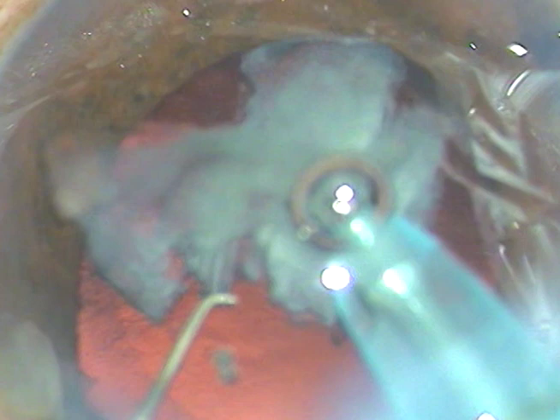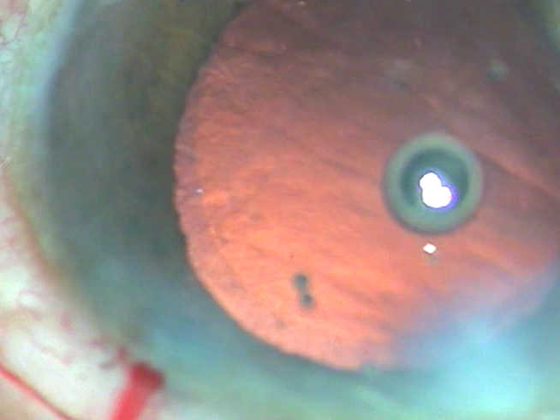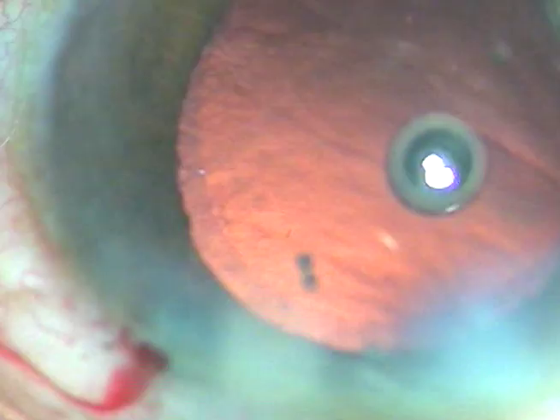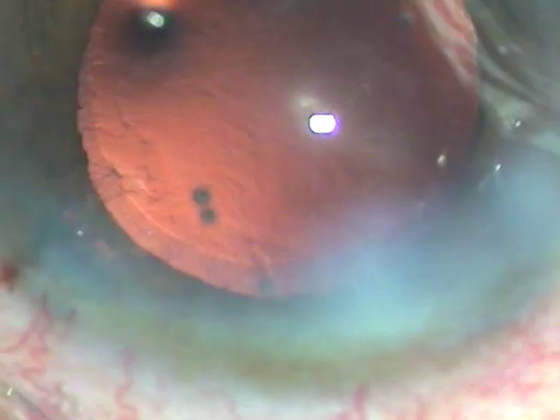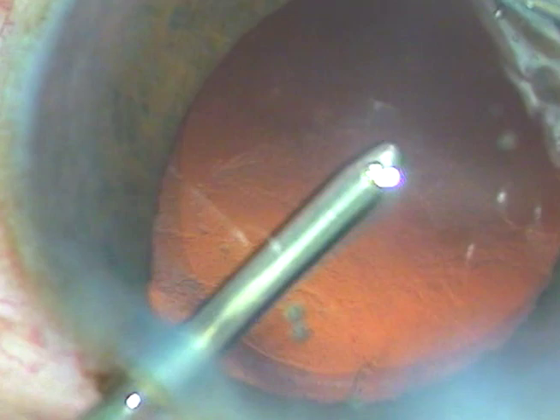The pupil has become a bit small and iris has prolapsed out through the side port. What you do at this time is remove the handpiece first, send the pupillary margin into the anterior chamber, and then remove the chopper. Whenever iris prolapses through the side port, remove the handpiece first — the intraocular pressure will reduce a bit, the iris will go into the anterior chamber, and then you remove the chopper.